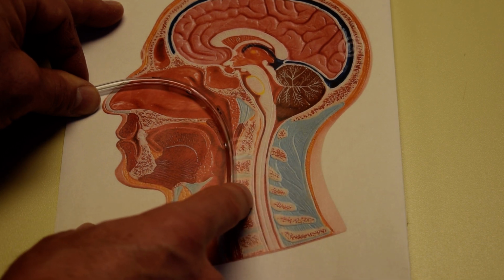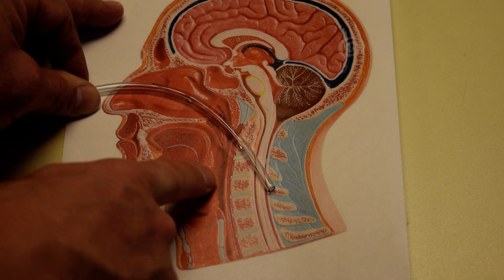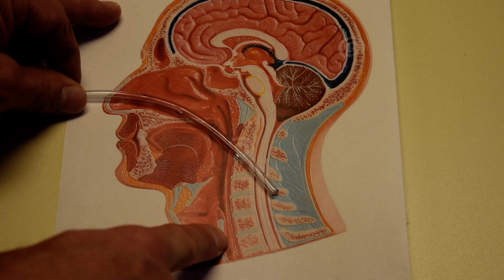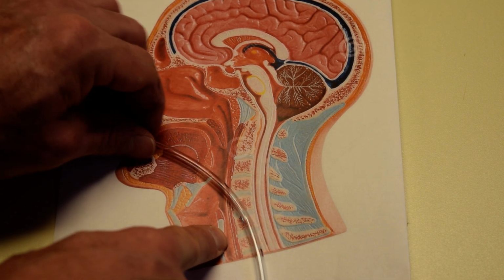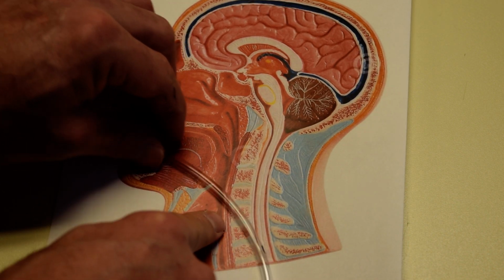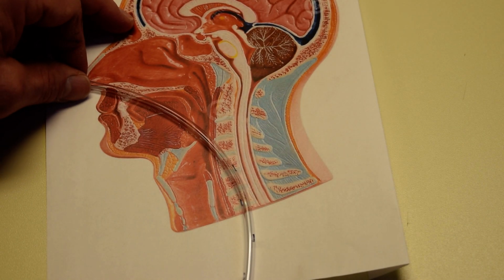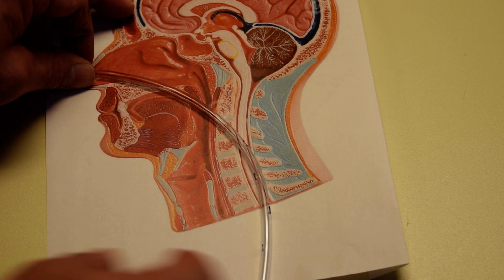And again, follow your instructions. Chin to the chest, swallow and grab at it as you go, and try to advance with the swallows. Go, click, swallow, swallow, swallow. Do it in steps, not in one rapid motion, and you're less likely to choke the patient or cause discomfort for your NG tube insertion.